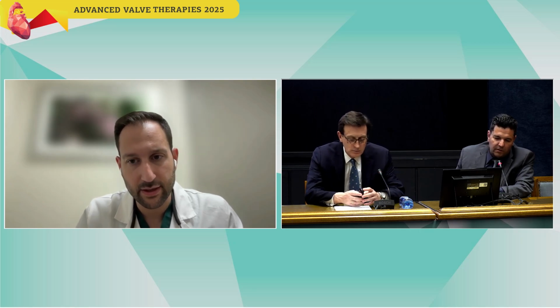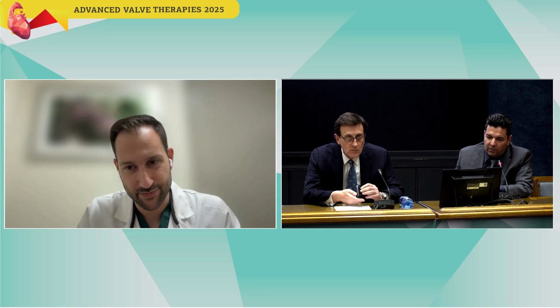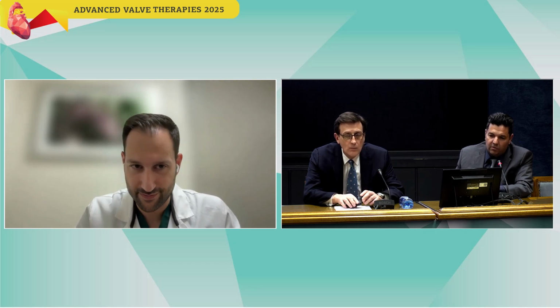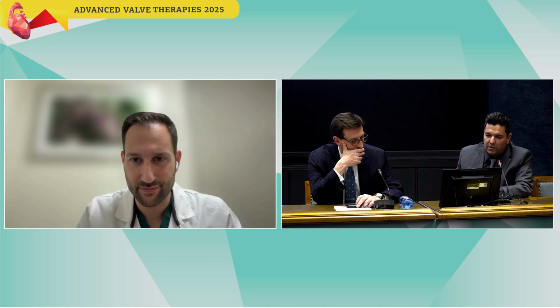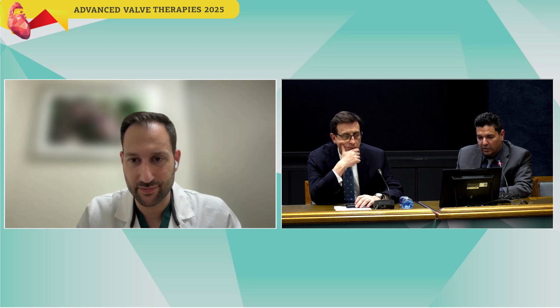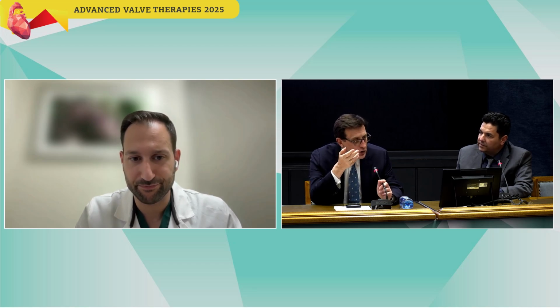We do something similar where I work, at Tampa General. We have 3D printing, and we try to do exactly the same thing you're doing: with the 3D printing, we try to put different valves in and see how much we obstruct the coronaries. But obviously what you're doing is much more accurate, it looks like. Well, it's good. Thank you. Maybe less costly. I don't know.